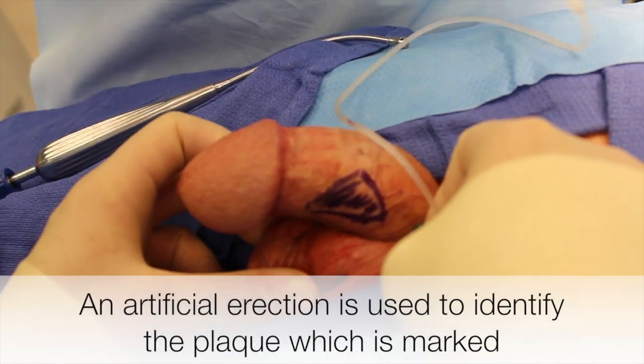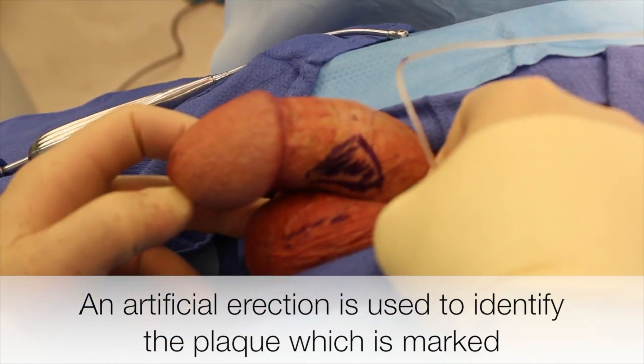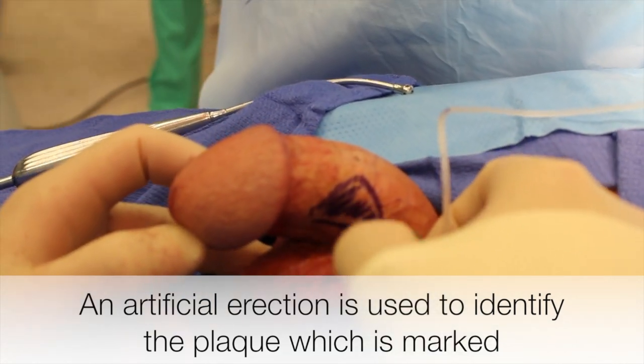An artificial erection is used to identify the plaque. Our fluid during artificial erection is anesthetic to also hydro-dissect the planes as well as demarcate the plaque.